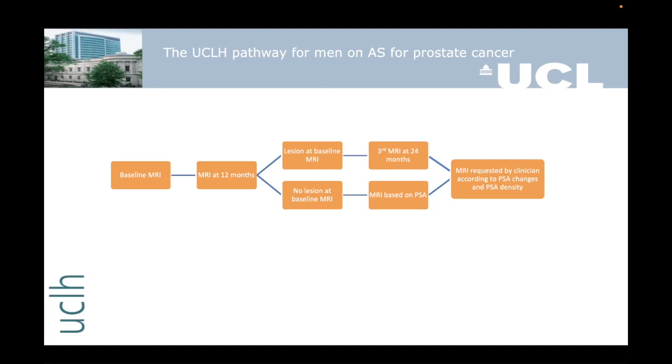Although he has had a visible lesion, now a more obvious lesion as time's gone on, PSA rising, more 3+4. You know, I think to adopt a pathway, as Veeru said, that they would not routinely do a biopsy here, I think is well outside guidelines. We should just remember that if you're selecting an otherwise fit patient for active surveillance with this type of visible intermediate risk prostate cancer, at the very least, a confirmatory biopsy is recommended regardless of imaging findings, but especially if the imaging is showing a lesion, I would say. So let's just remember there's more to active surveillance than just imaging.